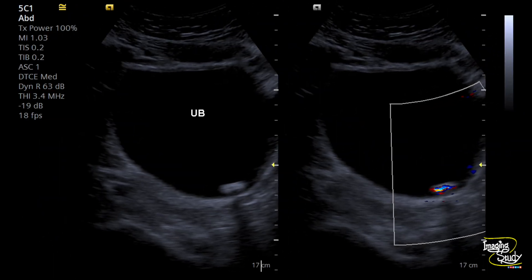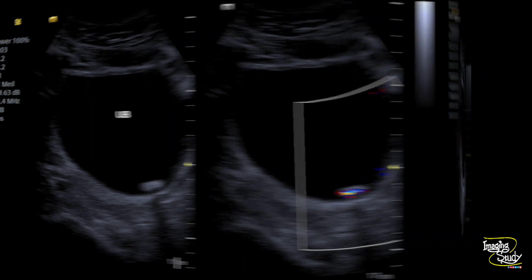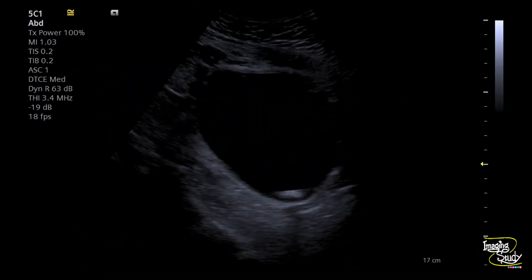Here is another image of the calculus. You can see the posterior acoustic shadow on grayscale and the twinkling artifact on color Doppler. Here is another image of this stone.